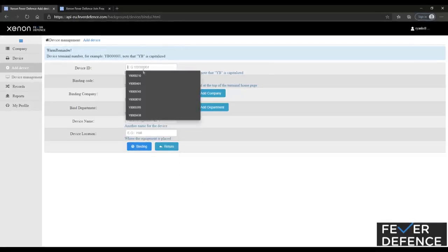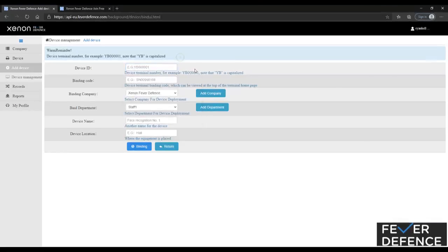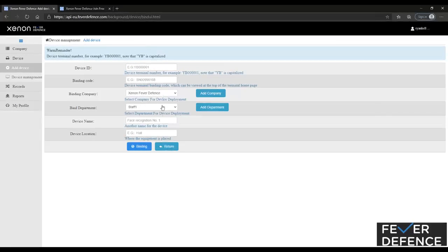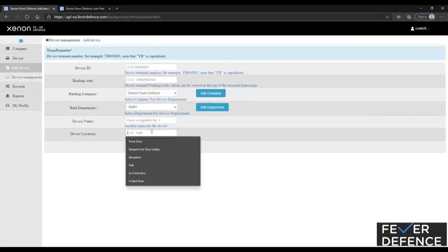You're going to type in your device ID and your binding code that you've gotten from your device. And you can add a location as well.